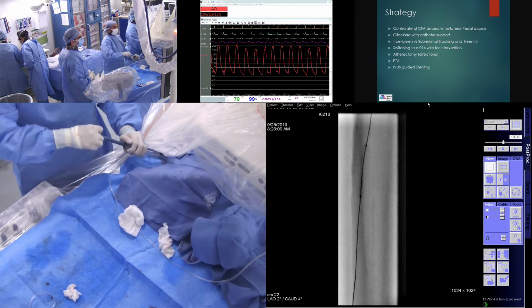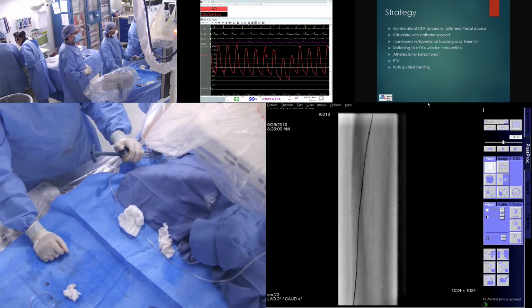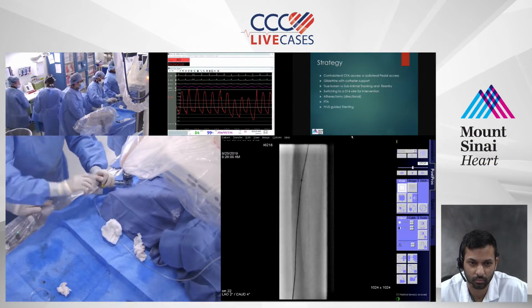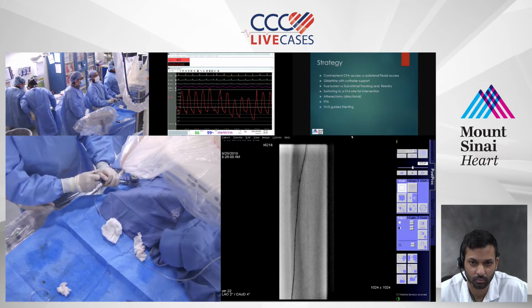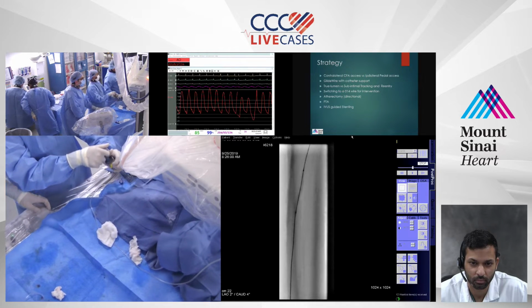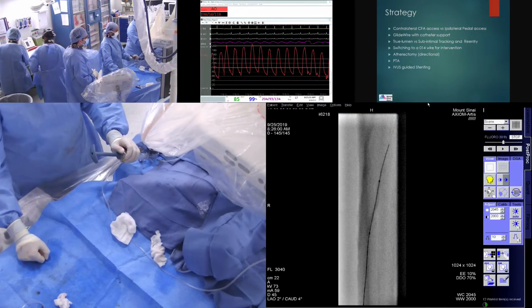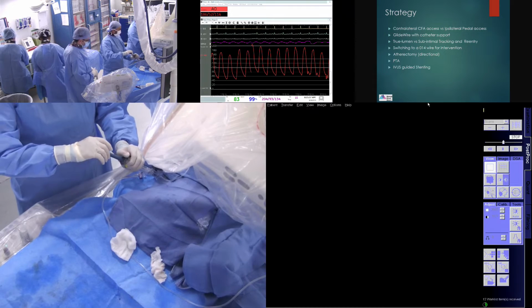You had mentioned that this patient doesn't have a good vein, correct? Yeah, oh yes. We did do vein mapping, which is interesting because of rest pain. He does not have good vein. And it's very difficult to get vein mapping in-house. We had to bring him back twice. I'm on a high fluoro here, guys, and I don't want to be on high fluoro.